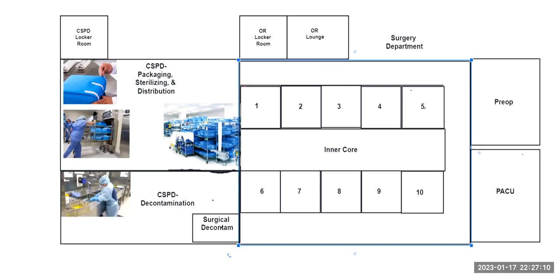Okay, now it's real important that you remember this flow, and that you are never going to take one of these clean trays and bring it back into decontam. This decontamination area is dirty. It has the microbes and microorganisms from hundreds of patients, okay? We don't turn over this space. We clean it, but it is not a space that is sterilized, okay? So we want to consider this area dirty and be very cautious with it. Do not bring clean items into a dirty area.